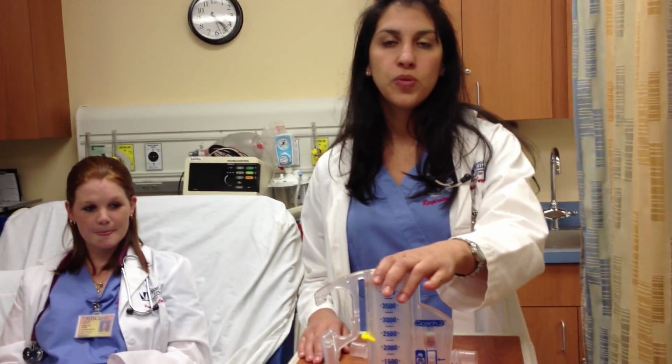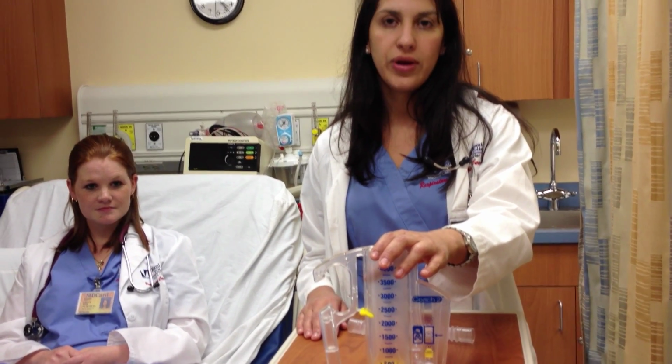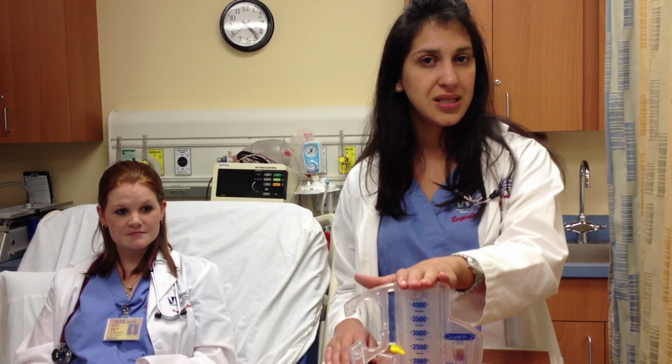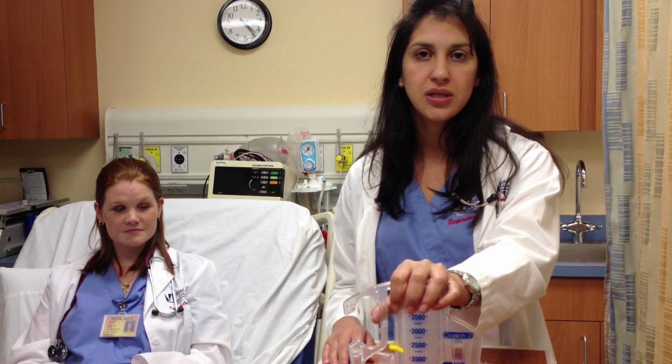For this reason, we will use this breathing device to mimic the natural sigh by fully expanding their lungs by taking deep breaths. Now that I explained to you the indications of this breathing device, I'm going to tell you the contraindications. Since this breathing device is so simple, we have very few contraindications.